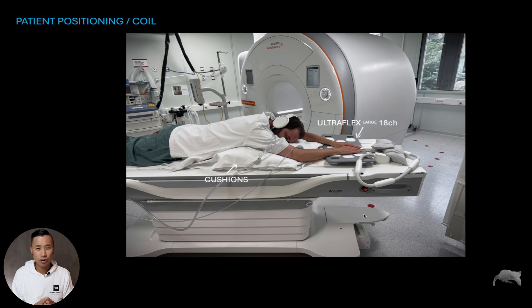I made a presentation to show you how we positioned the patient and the results we got from a healthy volunteer. We did this on a 3T scanner — I'm very sure it will work on 1.5T as well. This is a Siemens scanner, but it will work on every other vendor too. As you can see, my colleague is lying with both hands forward — head first into the table, lying on the stomach, arms forward in the superman position.